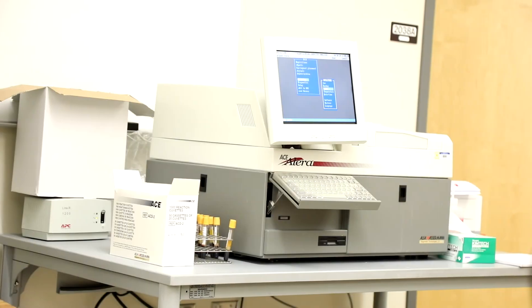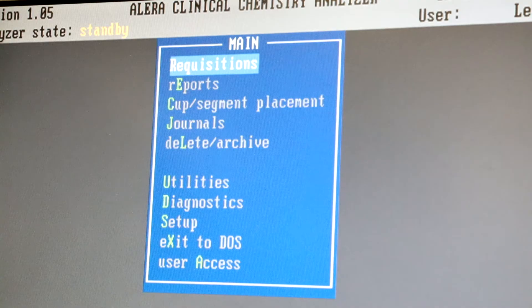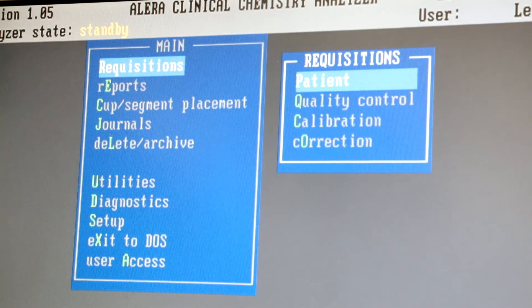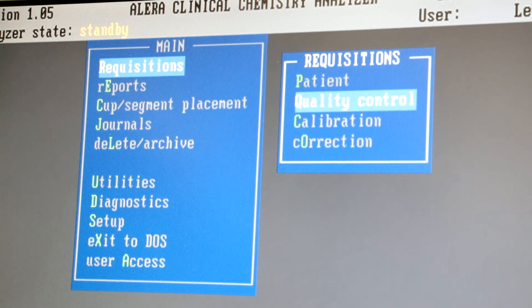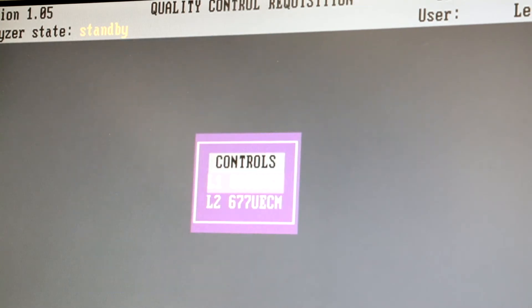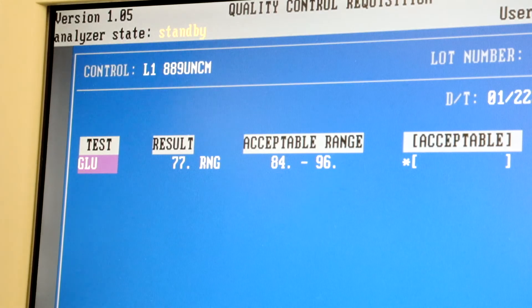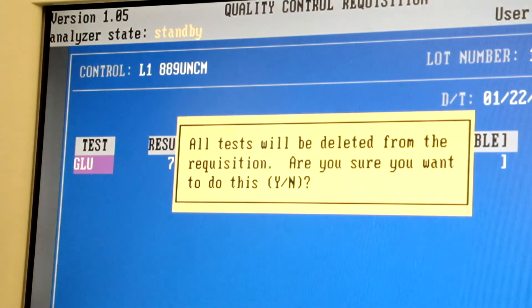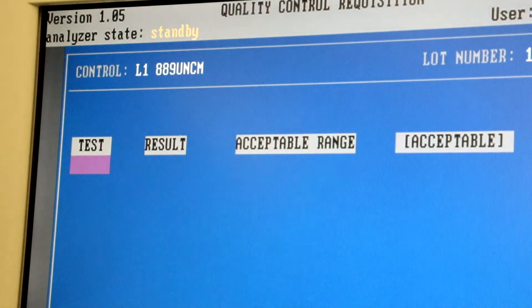To run Daily QC on the main menu, select Requisition and then Quality Control. Select L1 to order the tests for L1 QC. Press F6 to clear previous testing and then Y to delete the tests.